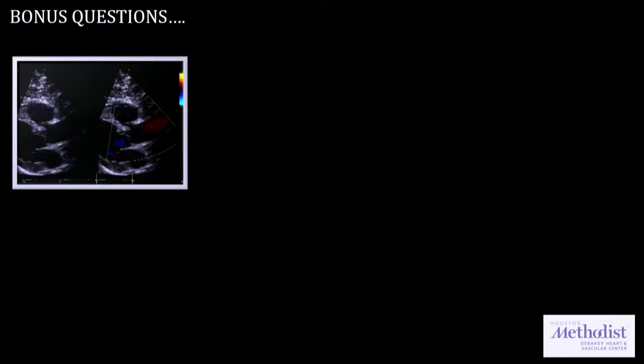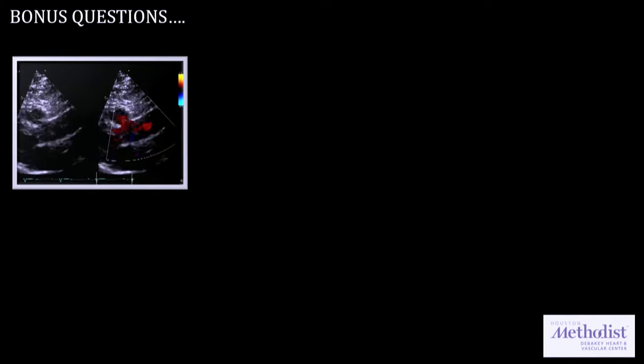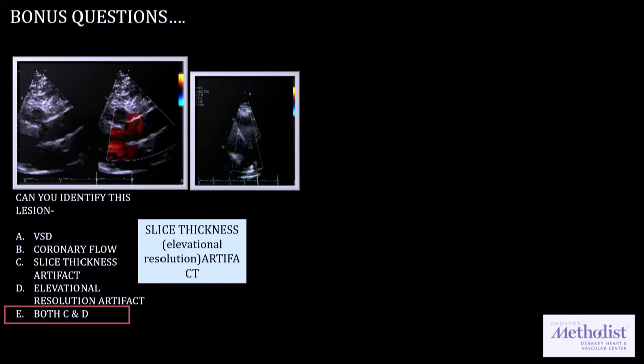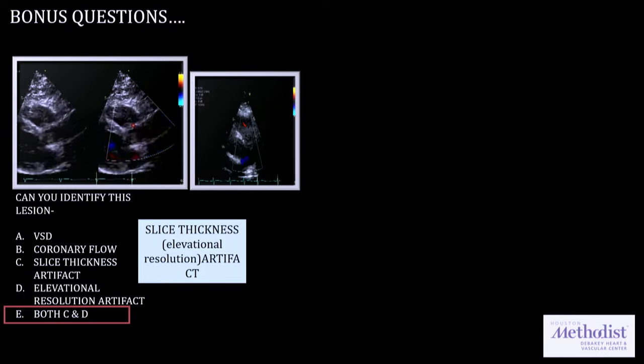All right, do we have time for bonus questions? I'll make it really short because I do want to leave some time for Dr. Pasha. That's a slice thickness artifact, guys. See this? It almost looks like there is a jet right here, but that's actually a PR jet you're catching from a different elevation, right?